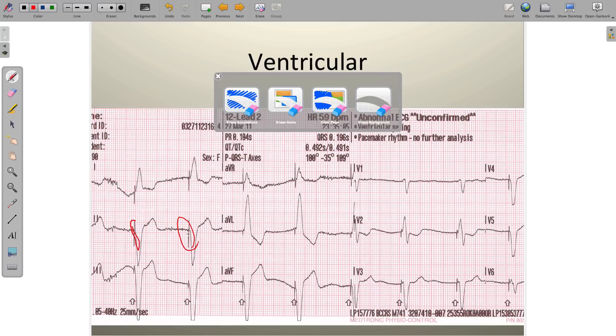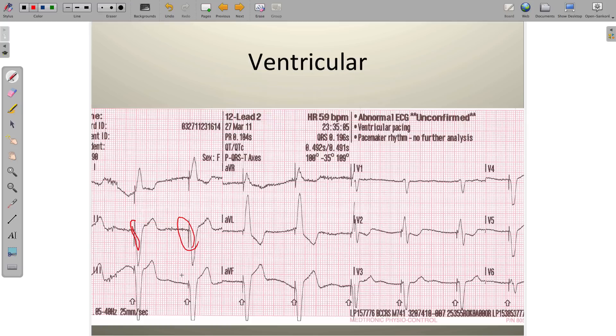A ventricular pacemaker features a single moment in time spike, and in addition to that, it's followed by a wide, bizarre-looking QRS complex. This wide, bizarre-looking QRS complex is then followed by a T wave that's pointing in the opposite direction — QRS and T wave discordance. The QRS complex is negatively oriented and the T wave is positively oriented, and you'll see that across pretty much the entire tracing.